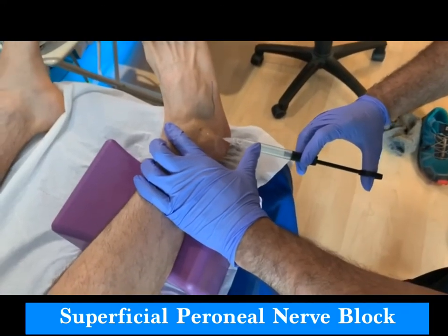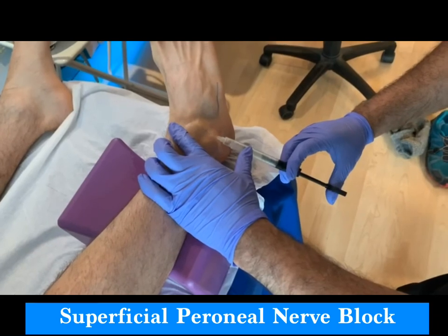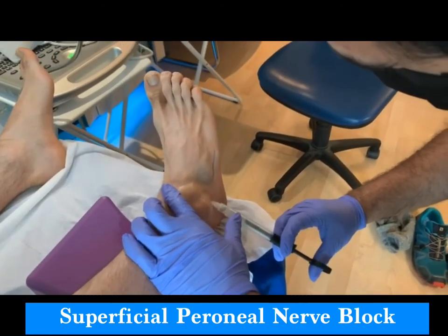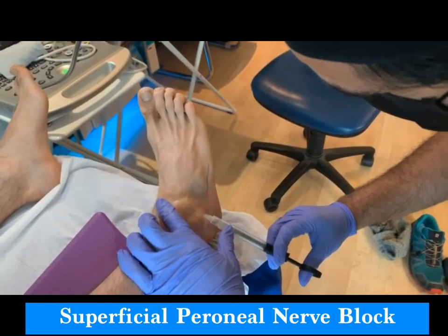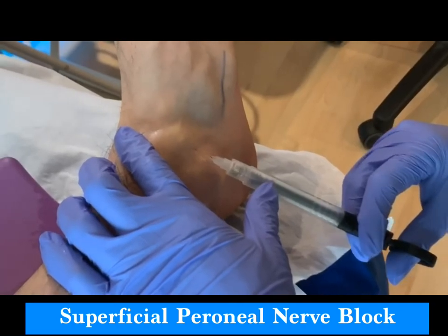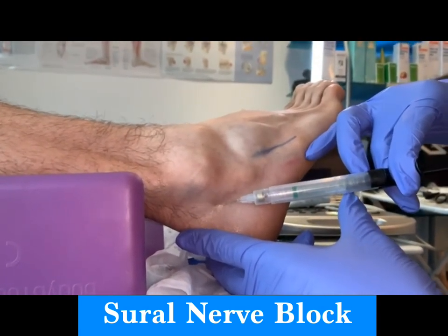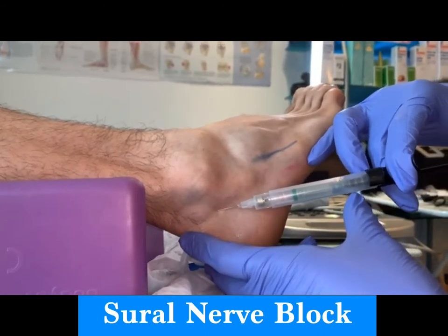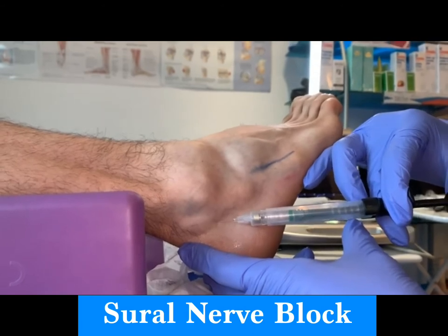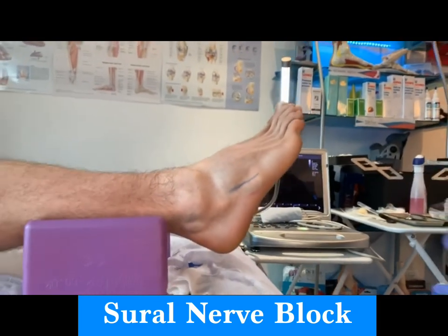We're just going to put up a little sausage here. The superficial peroneal nerve is, as the name suggests, superficial. The deep peroneal nerve we have to go in much deeper. We're using Scandicaine because it's quite quick acting. The sural nerve runs across there — you don't need a lot for this. That's probably the fifth metatarsal there, and that's the peroneal brevis just attaching into the fifth metatarsal.